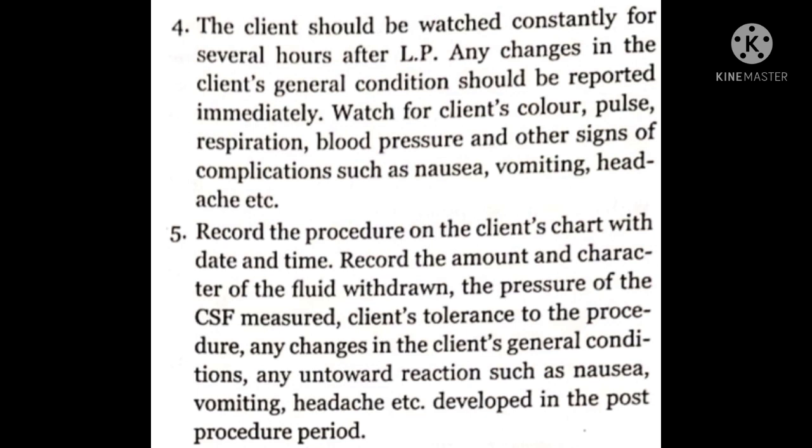4. The client should be watched constantly for several hours after LP. Any changes in the client's general condition should be reported immediately. Watch for client's color, pulse, respiration, blood pressure and other signs of complications such as nausea, vomiting, headache, etc.